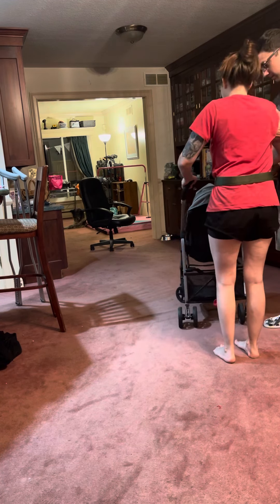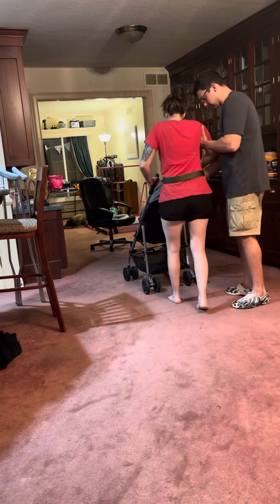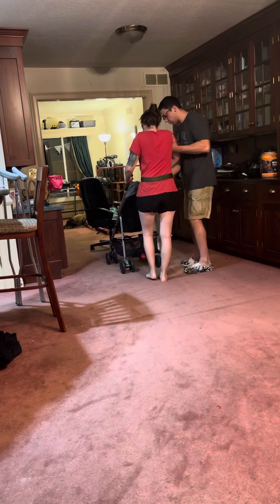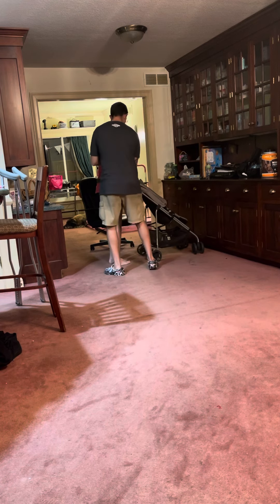Go ahead and head back to the chair. One more big push for me. All right, we're going to turn to the right — a little shuffle. Make sure you keep leading with that walker now.